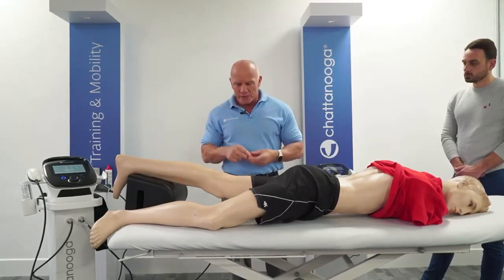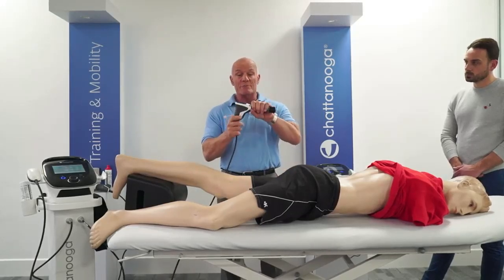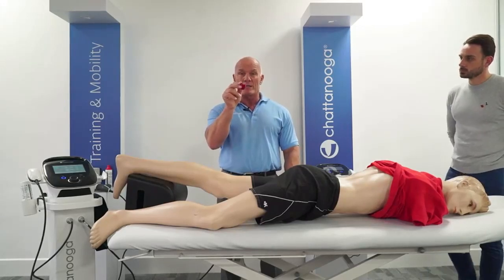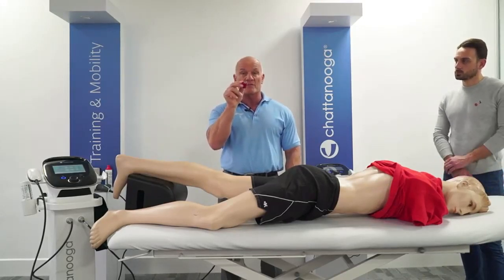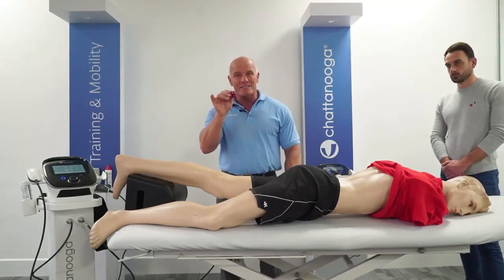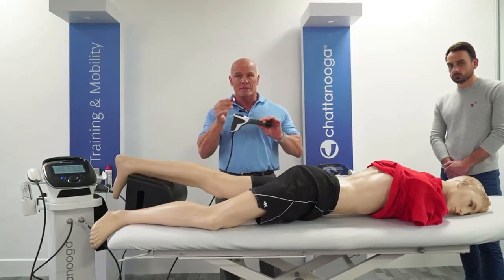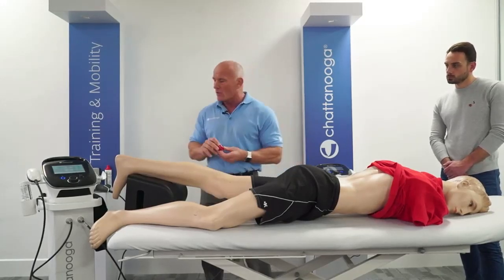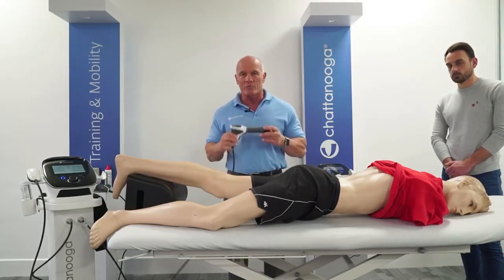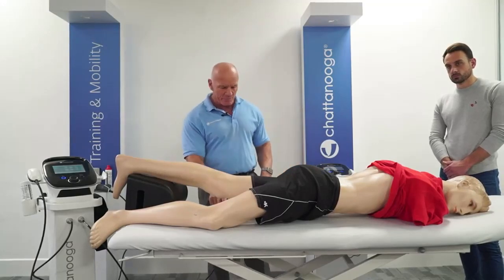You can get another manufacturer with the same specification and their version of a 15 mil transmitter producing only 0.18 millijoules per millimetre squared. That's half the value. Hopefully that demonstrates why it's so important to understand what energy is coming out of the transmitters. Okay, we can move to the next slide.